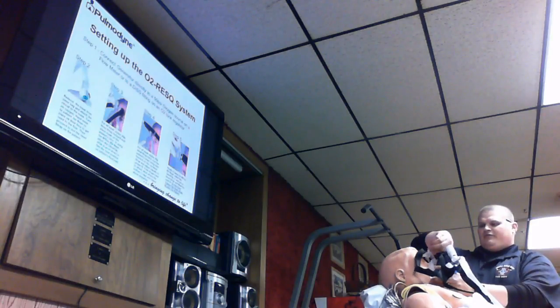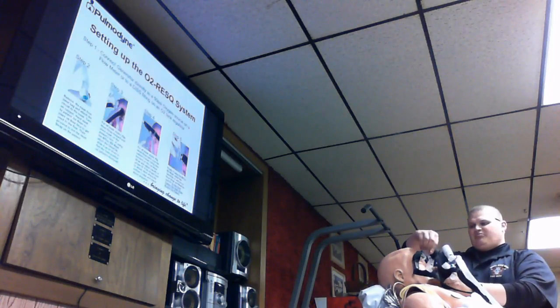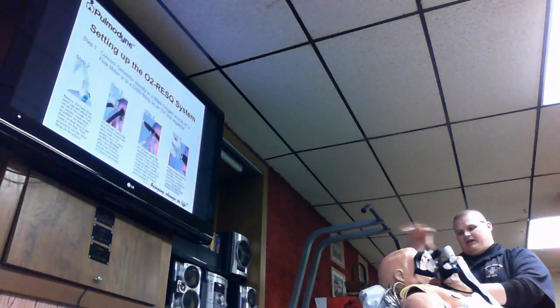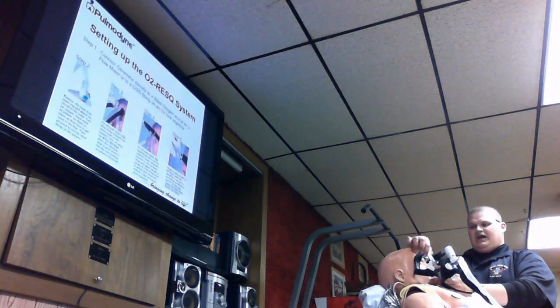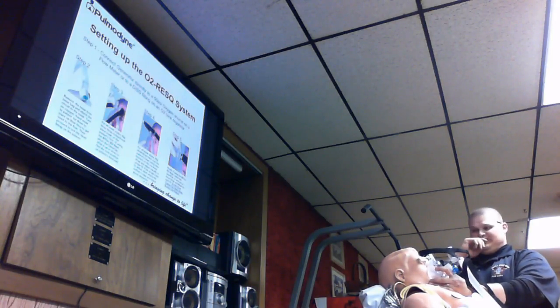Then you take your forehead adjuster and your mask adjuster, get it lined up so it's just above the eyebrows. And this is kind of a squeeze and pinch. You can actually move it forward or backwards, and I have to hold it on that pressure. If I need to relieve it, I can press the pin and have it back out just a little bit too. Okay, and I'll have everybody come up here and do this in a second.